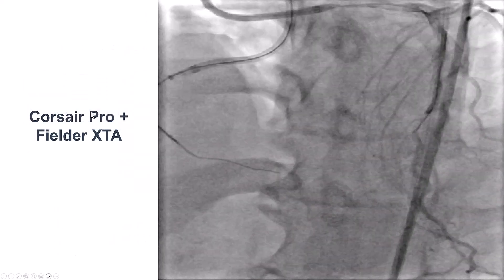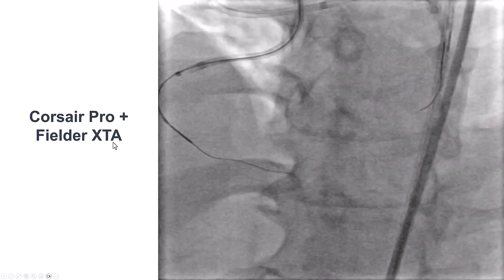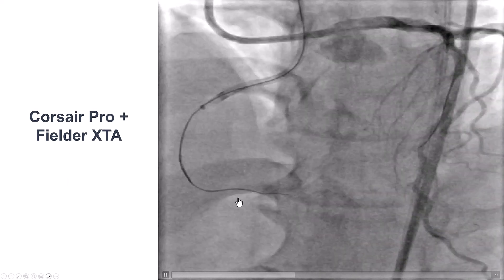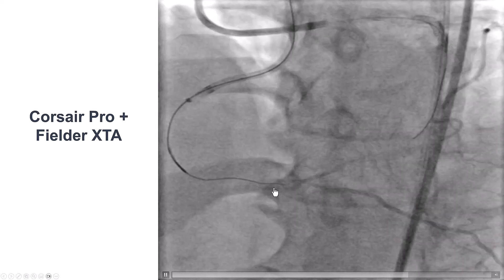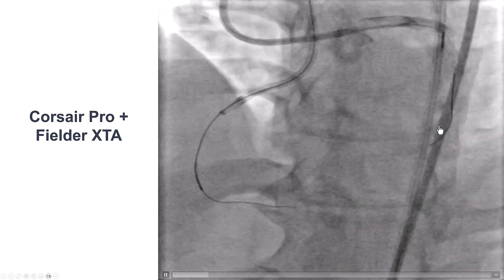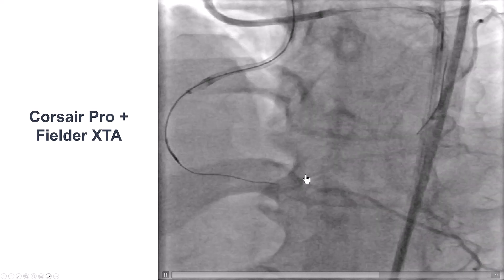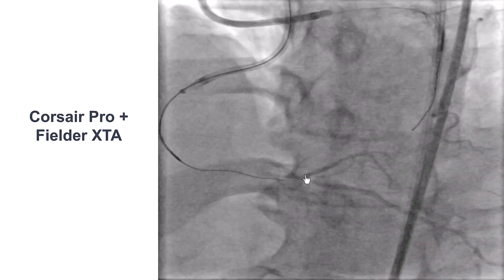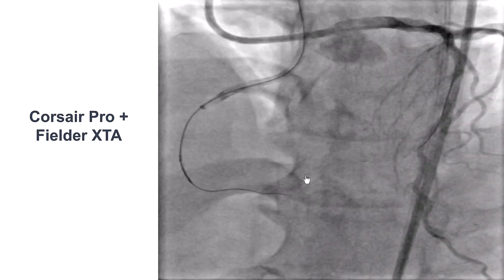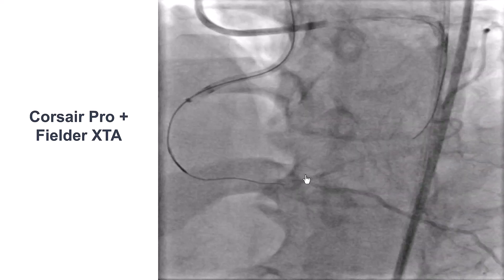We started first with a standard microcatheter, a Corsair, and a Fielder XTA guide wire. However, the wire went into the extraplaque position, as we can see from the retrograde injection. This was a little frustrating because we were hoping and expecting that the wire would have gone into the distal true lumen.